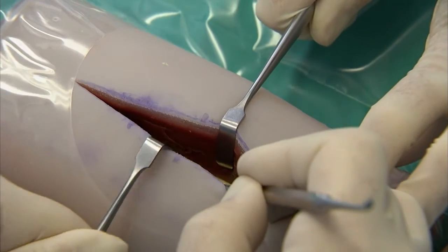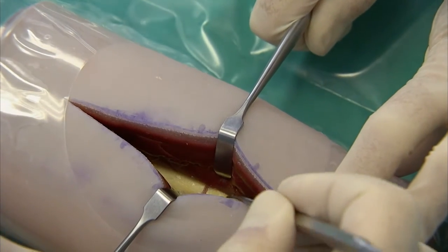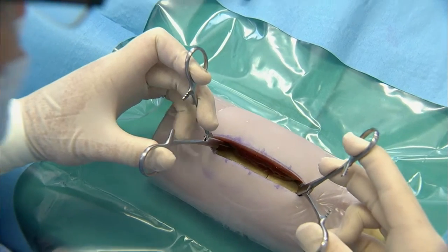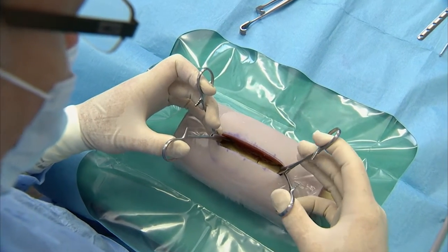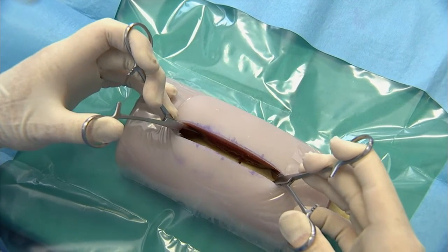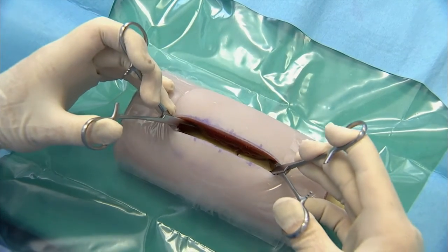Remove any excess hematoma or tissue that is noted in the fracture between the 2 bone segments. Place repositioning or bone-holding forceps on both sides of the fracture, but some distance away from the fracture line. Perform a test reduction. If you are confident that you can attain a good reduction, place the plate over the fracture line.